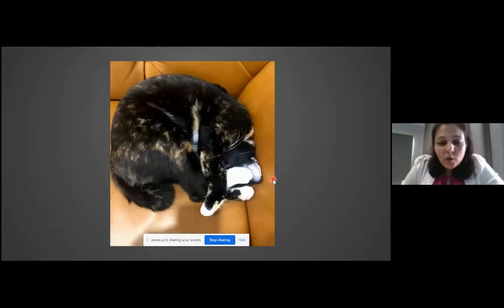Right, so I hope all of you have not cuddled up and taken a nap. I'm nearly at the end of the presentation. Just want your attention for a few more minutes.